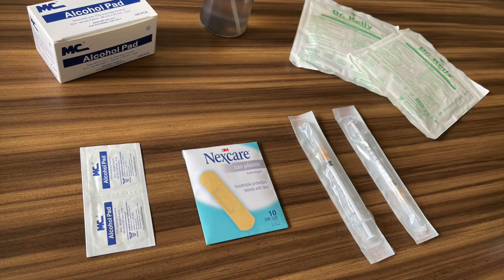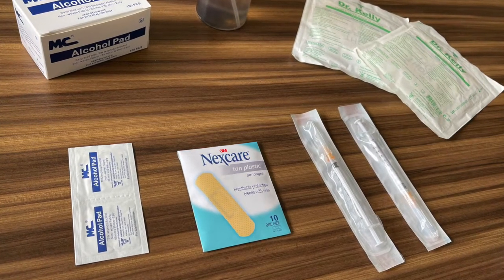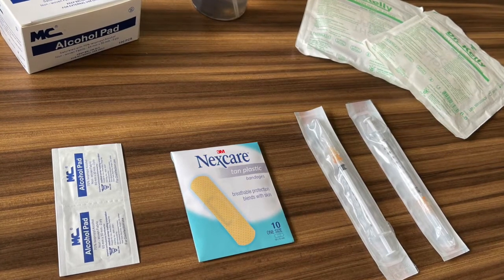Hi, good morning. My name is Clark Wilon, and I'll be demonstrating to you how to administer vaccines via intramuscular, intradermal, and subcutaneous routes. So these are the materials that are going to be used. We have the syringe, the band-aid, the gloves, and the alcohol swab.